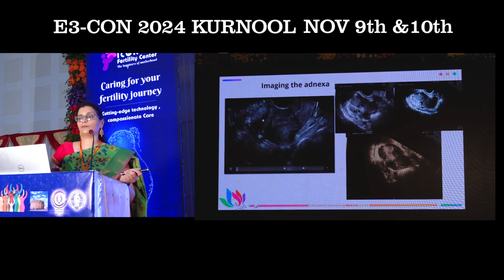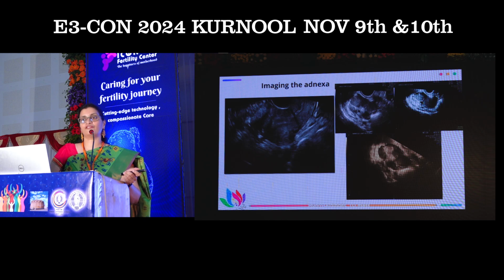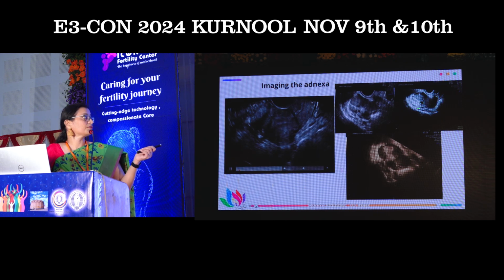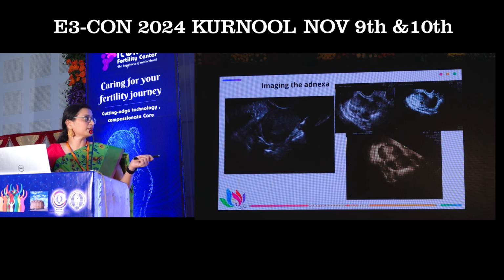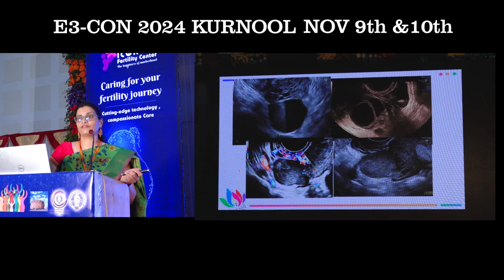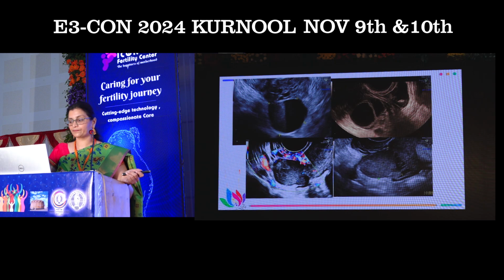Usually normal fallopian tubes we do not visualize on the normal scan unless there is free fluid in the pelvis or if there is a pathology in the tube. So whenever there is a hydrosalpinx, you can see a mass here, a tortuous mass with incomplete septations. That is a 3D rendered view. That's a hydrosalpinx. So that we can find on that view.